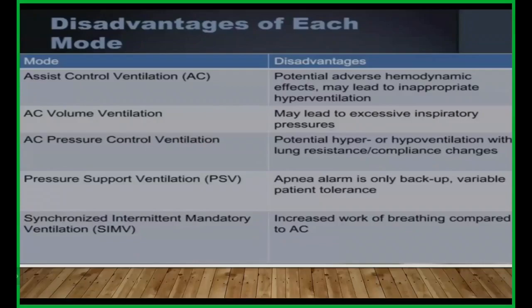And this pressure support ventilation is not ideal for all patients. It depends upon the patient's tolerance to the changing pressures. So this mode cannot be set for all patients. Now SIMV mode has increased work of breathing compared to assist control ventilation. Otherwise, it's a good mode.